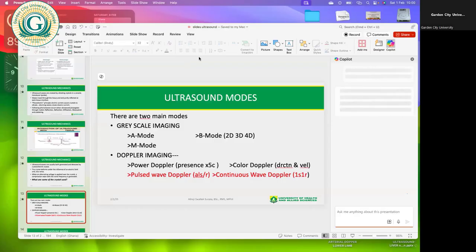Okay. So again, on the B mode, when we say B mode in ultrasound, we are referring to ultrasound images being interpreted on the brightness scale. When we say brightness scale, we mean from very black, pitch black, to very white, pure white. These particular illustrations of black and white are in reference to densities of structures. We are all aware of what a density is, are we not? How dense, how compact the structure is.